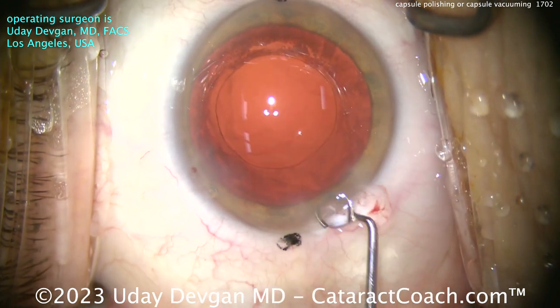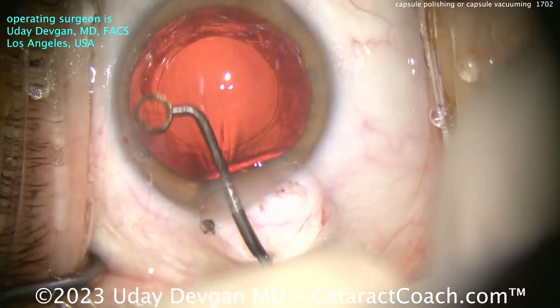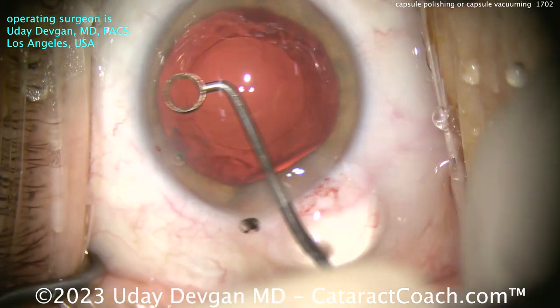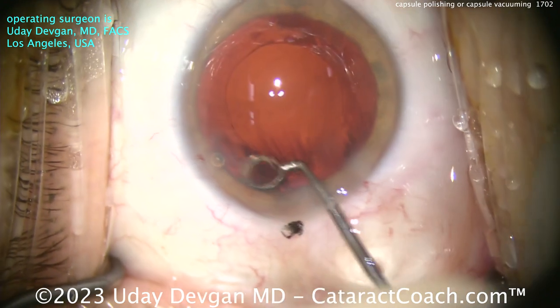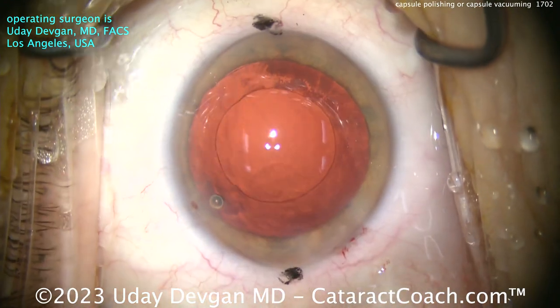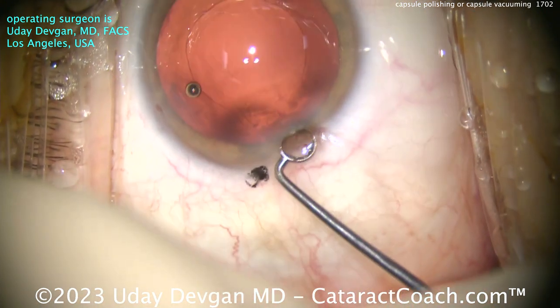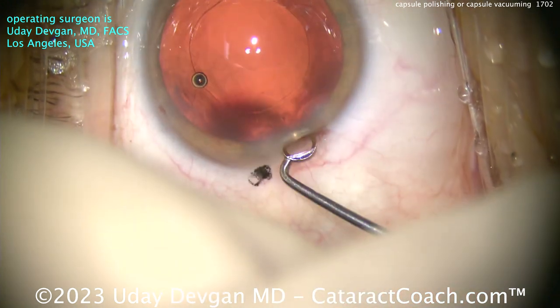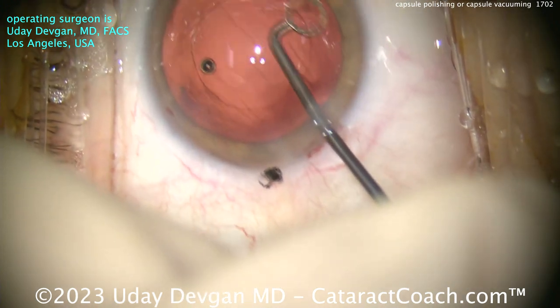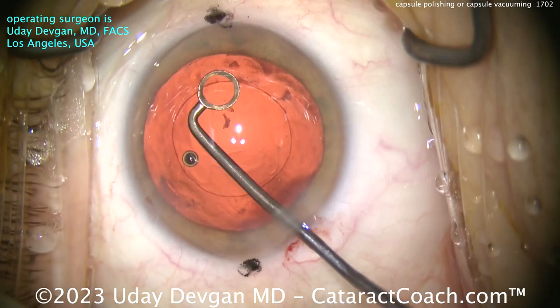Here's a capsule polisher. I'm going to go here and use this device to mechanically polish or scrape the undersurface of the anterior capsular rim. You can do about 180 degrees this way, flip the instrument over, and then do the other side as well. That cleans it up pretty nicely. But is this sufficient? That's the big question — and I'll say it's not really going to do a whole lot. You look at this picture, it removes the material, it looks pretty good, you're pretty happy — but is that enough?